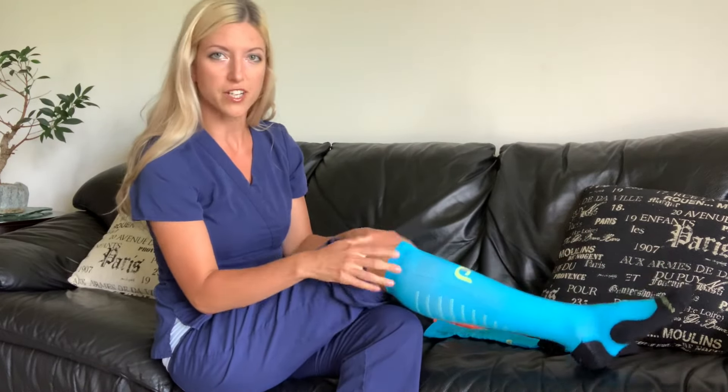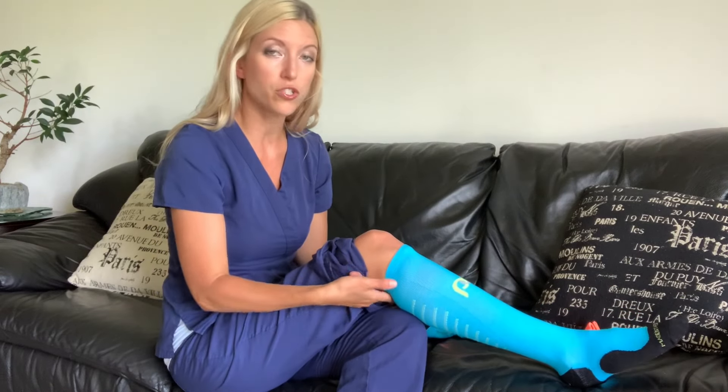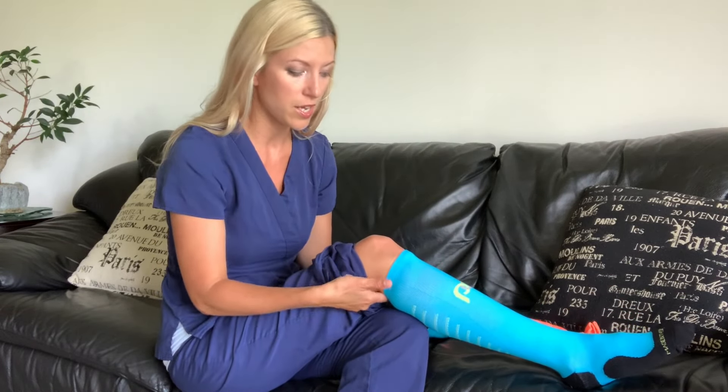Compression socks should stop right below the knee. I like to do about two finger widths below the back of the knee so that it doesn't bunch up when I'm wearing them.